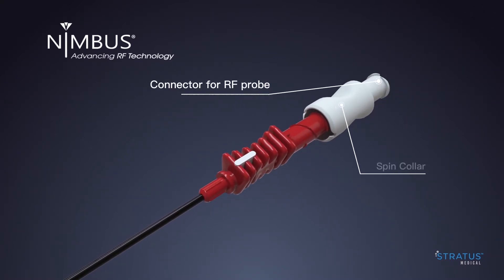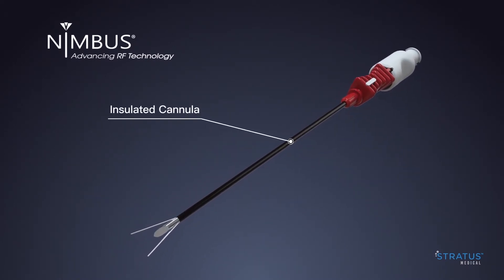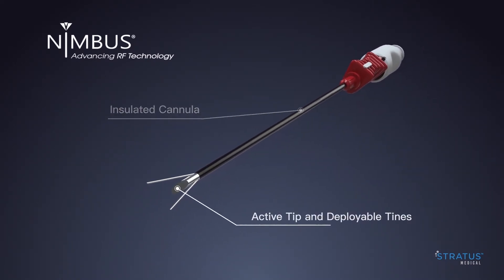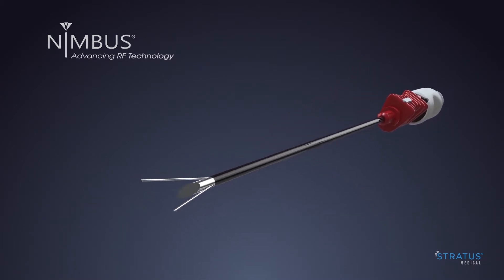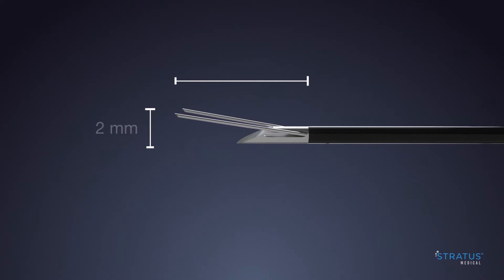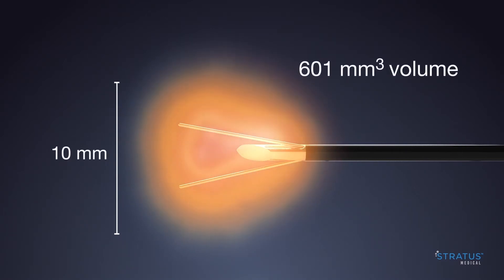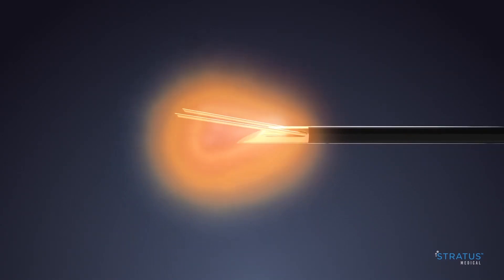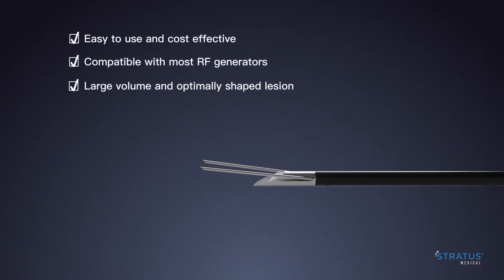The Nimbus tines are deployed by turning the spin collar clockwise. Nimbus is an easy to use, cost-effective radio frequency ablation device that delivers a large volume, optimally shaped lesion. Nimbus checks all of the boxes interventional pain medicine physicians, ASCs and hospitals have been asking for.